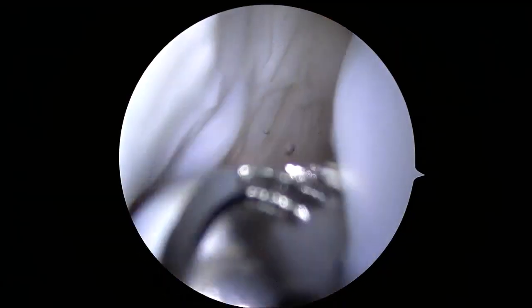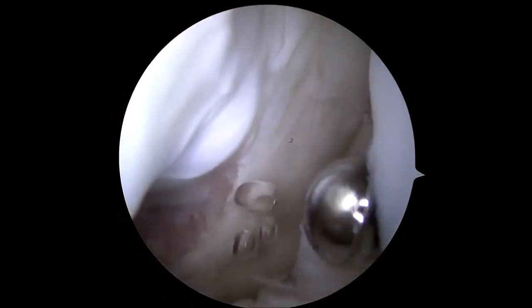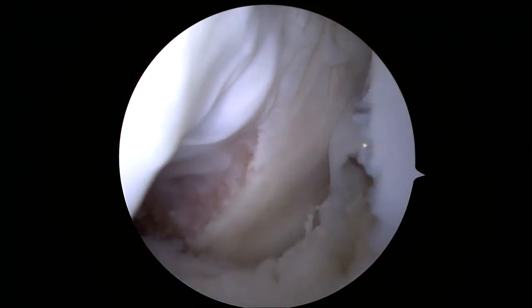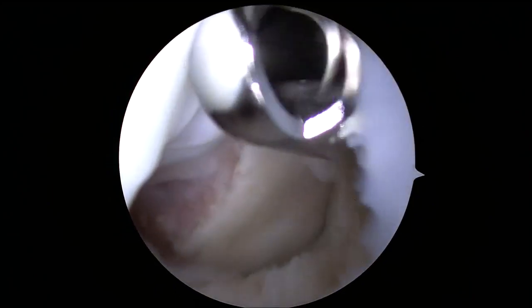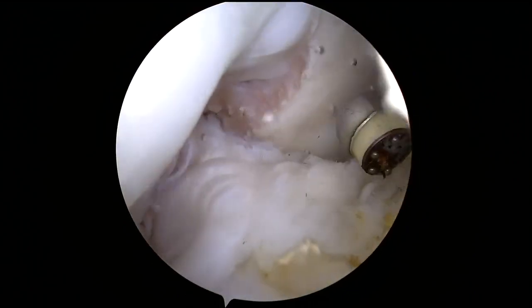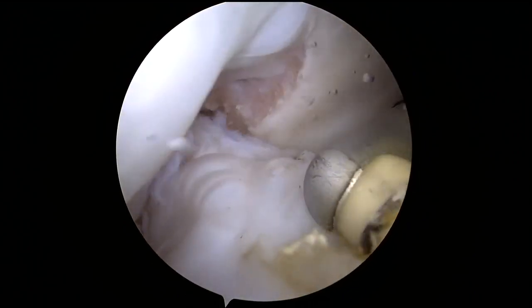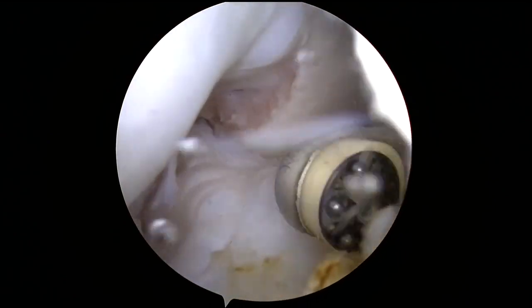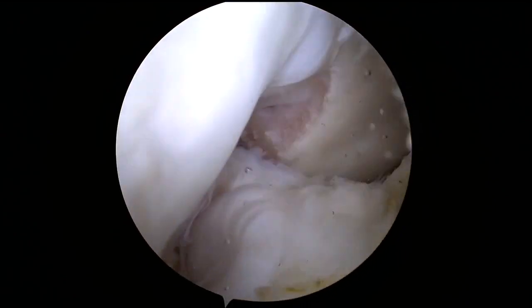A combination of shaver, coblation, and Cobb elevator are used for the lysis of adhesions in the anterior compartment, suprapatellar notch, and medial and lateral gutters. During the arthroscopy, the cruciate ligaments and menisci are assessed for injury. In this patient, the previous ACL reconstruction and medial meniscus repair are intact.